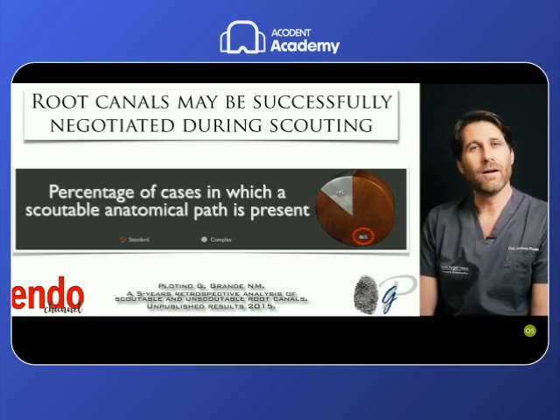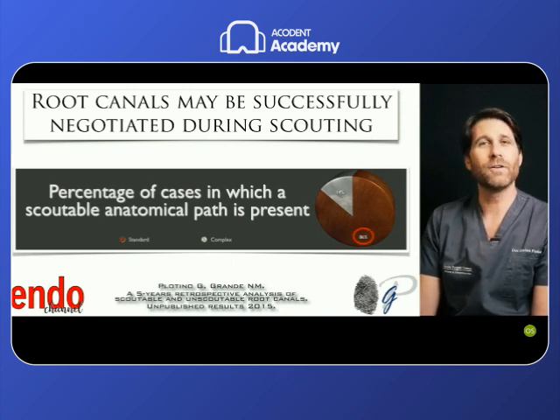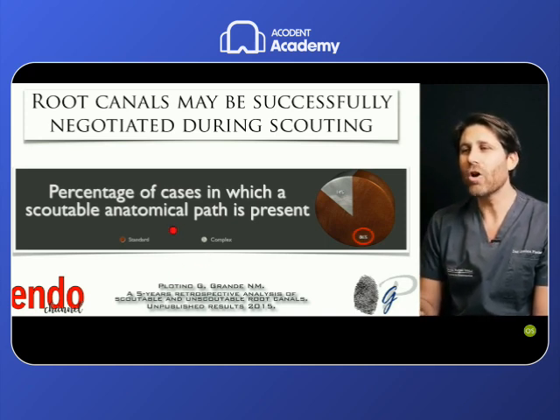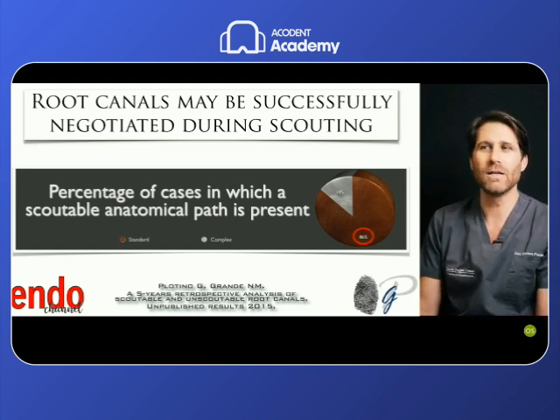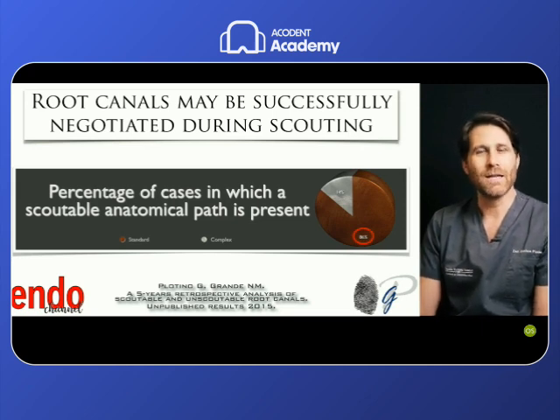In my past years, I have reviewed the cases that I have performed, and I have seen that the root canals are patent and the anatomical path is present and scoutable in around 85% of the root canals. Those are all root canals that I have treated, so probably in the anterior teeth, single-rooted teeth, this percentage can be increased to 90 to 95%, while in molars, where the scouting may be more difficult, it can be reduced to 75-80%. Those are the percentages that I can give you.